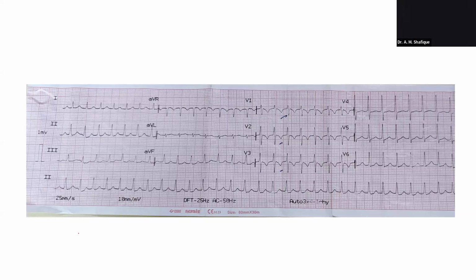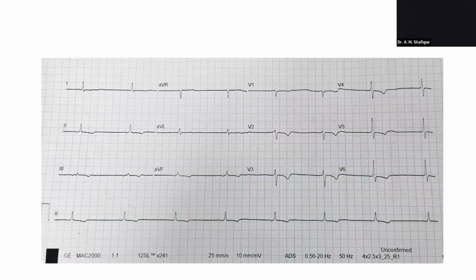It was done in the emergency department, and the patient came for ECG intubated. At that moment the patient was in sinus rhythm, and this was the ECG in CCU. The patient was intubated, and was on inotropic support as well.